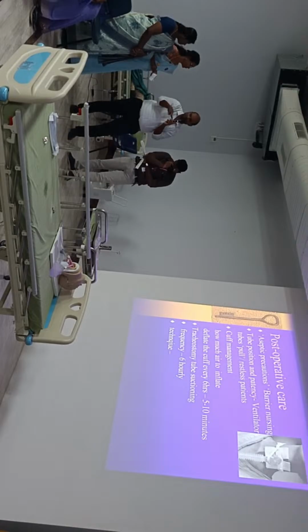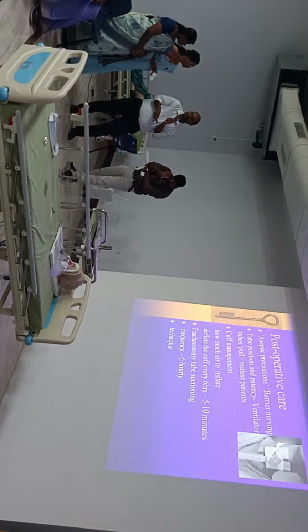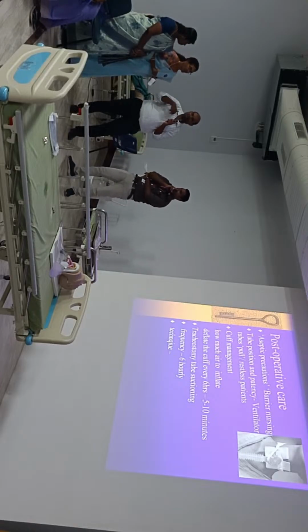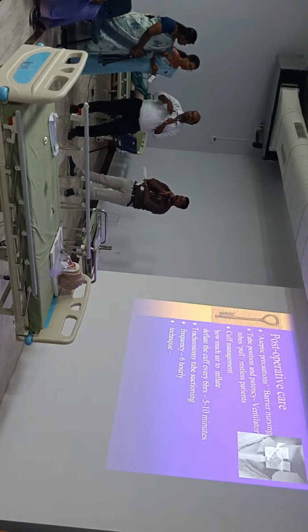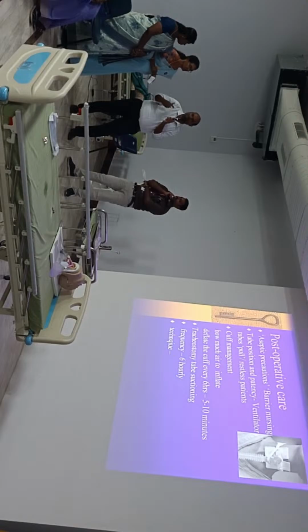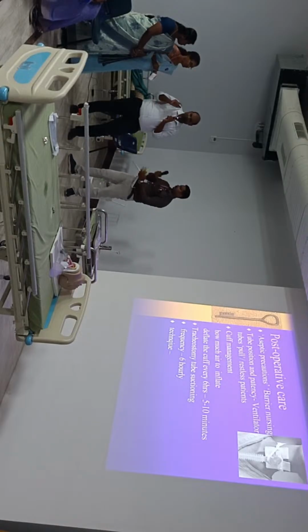Around the tube or below the tube, there will be multiple granulations. Once you take the tube out, that will entirely collapse, or once the patient starts coughing, there will be blood-stained secretions. Then the patient, caring staff or doctor, everybody will be in panic about why there is blood from the stained spot. So ideally, the recommended material is the Portex one.